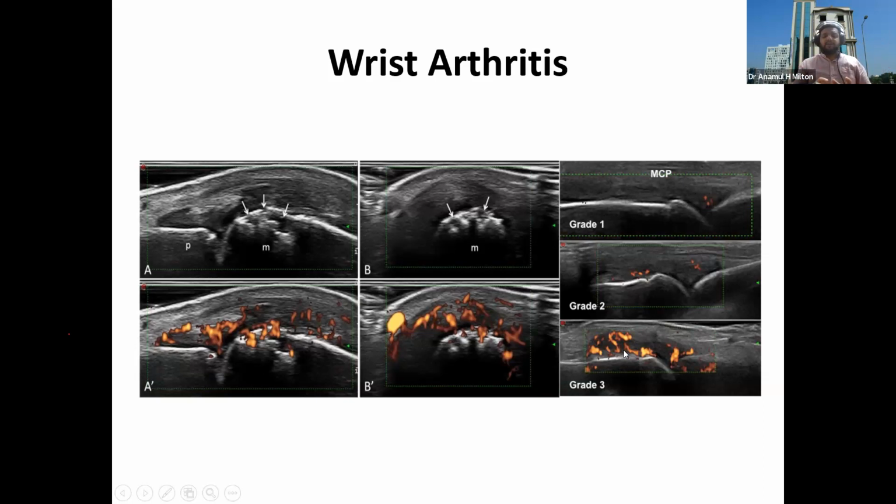If the collection is so much and the inflammation is so high, then you have to consider it grade 3. Oral medication like oral steroids or oral NSAIDs is not enough to minimize this kind of inflammation. At that time you need intra-articular injection also. So with the Doppler study, you can grade and plan how to treat this patient.